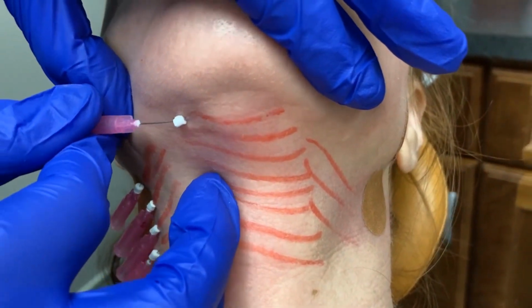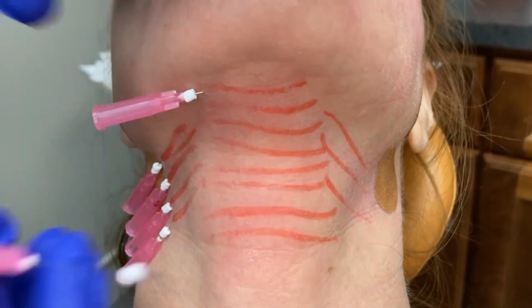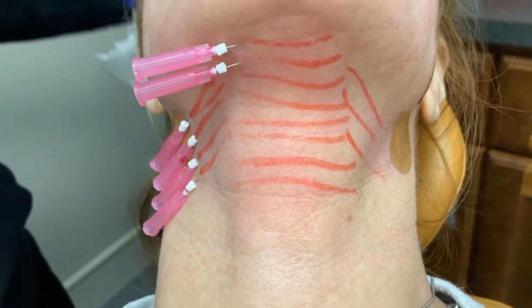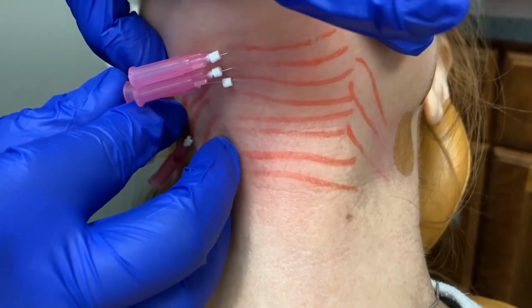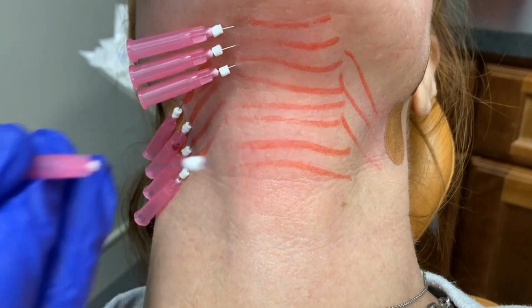As you can see, we've mapped out this patient, and the ones on the side are for the horizontal lines. But this right underneath the chin is also going to permanently remove chin fat as it goes through that fat pad, and then the body will build collagen to tighten all of the skin. So you really get a dual action in doing this.